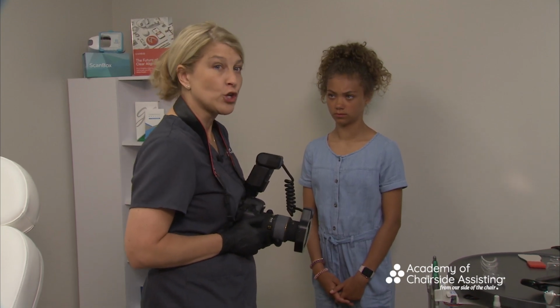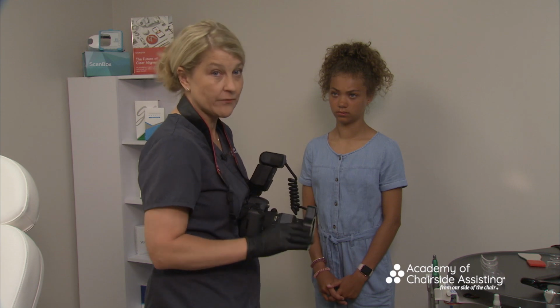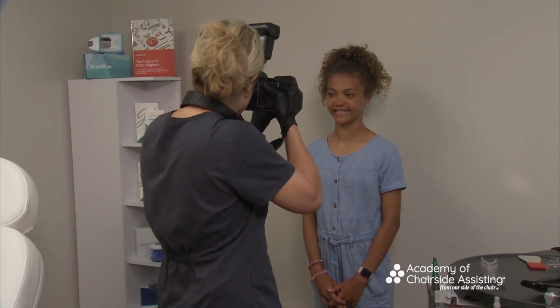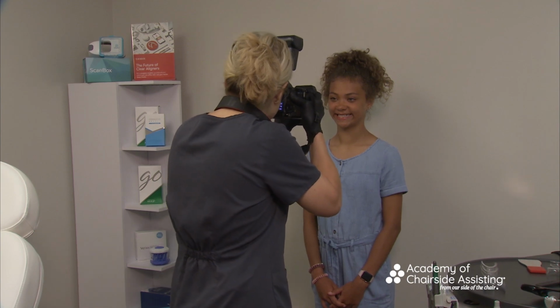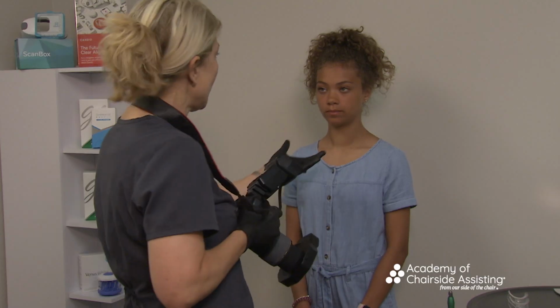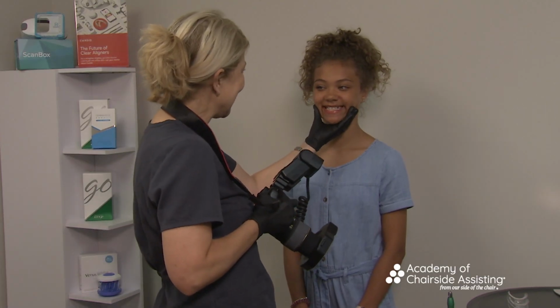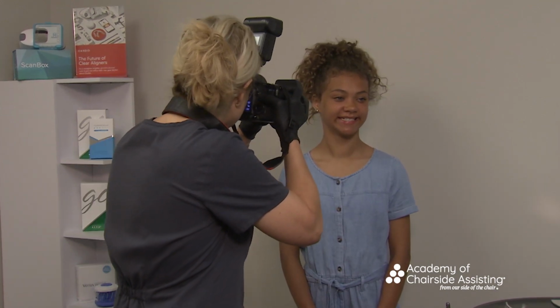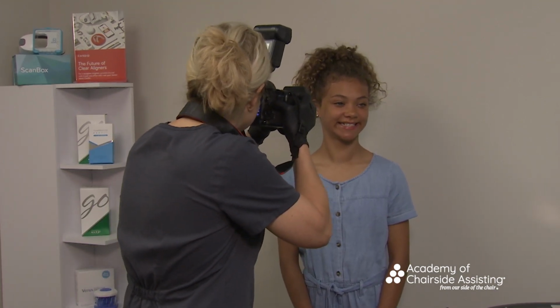And I just want to demonstrate those to show you, because remember, you're going to decide what sequence of images you're going to take. So this photo, again, going back to the smile, and let's just say we're going to shoot a smile for Kylie. Now what I'm going to do is I'm going to have what we call the lateral shot. So I'm going to have Kylie smile really big and turn her head just a little bit to the side, and I'm going to come in, and really my focus is going to be on the lateral. Big smile.